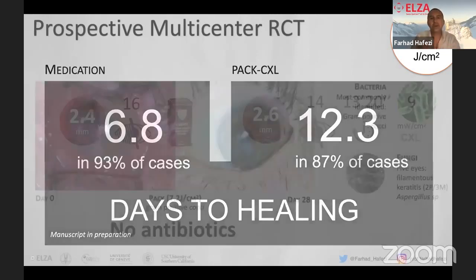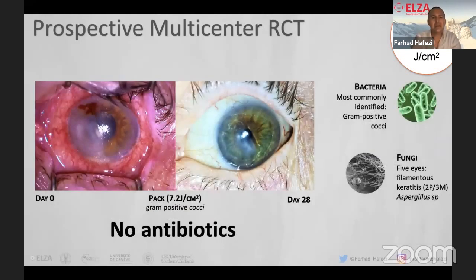And let me show you an example. For example, here, this is a case that was treated with light and vitamin B2 alone. Now, do not misunderstand me. I'm not saying to leave antibiotics for now. No, this was a trial to show the isolated effect of PAC cross-linking.